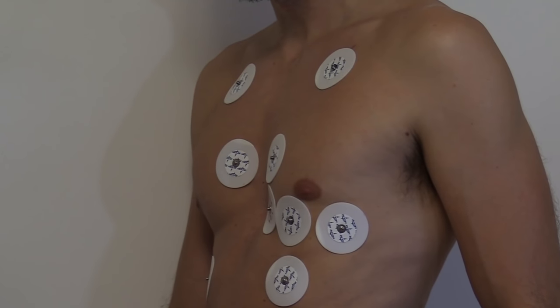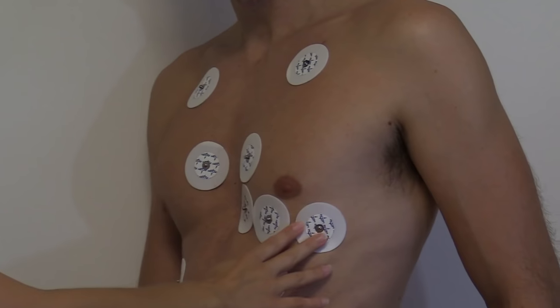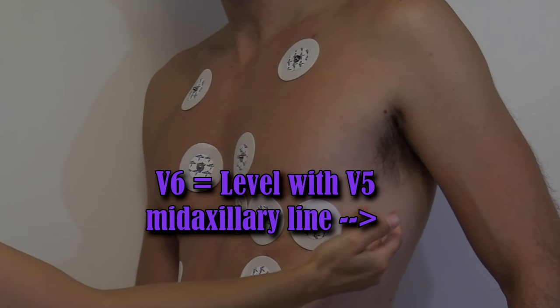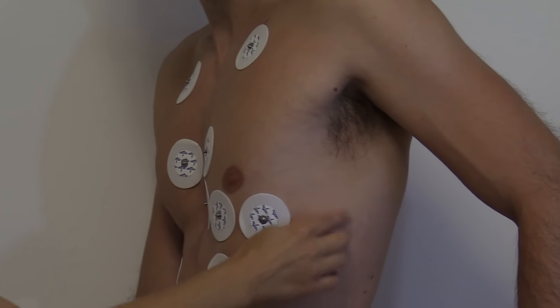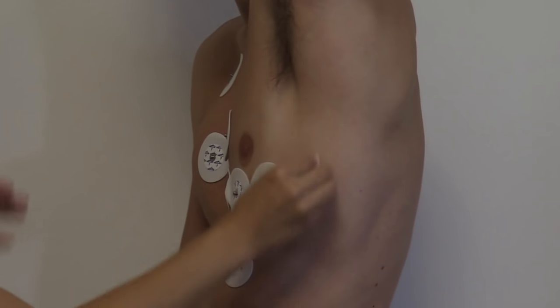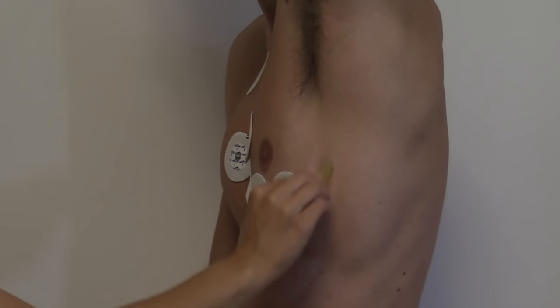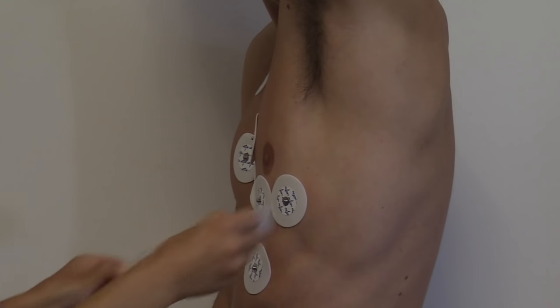Our last one is V6. V6 is going to be level with V5 but at the mid-axillary line — literally right underneath the armpit, so right here. Cleanse it, rough it up, and put our electrode.